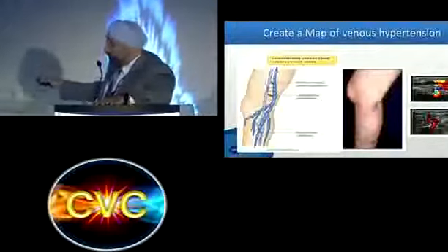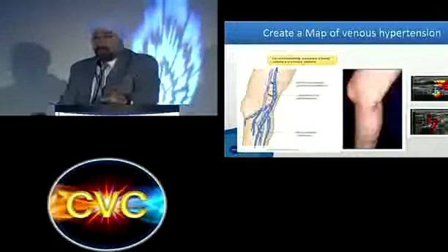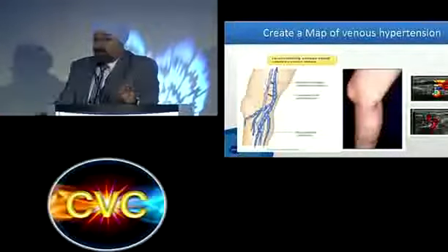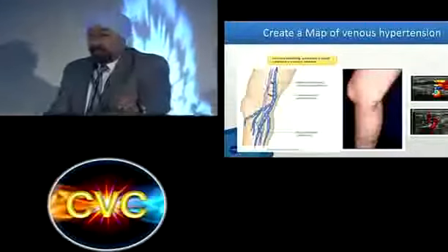I'll try and do both, but oftentimes once you do the first one, the second one may or may not be easily accessible, from spasm in that system, or just when you give the anesthesia. Oftentimes you don't need to use much tumescent in that region, just enough around the tip, depending on what you're using.